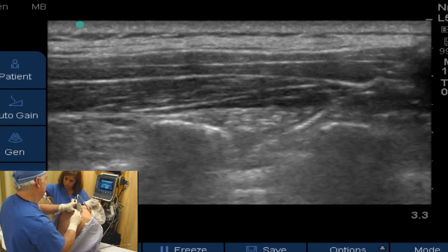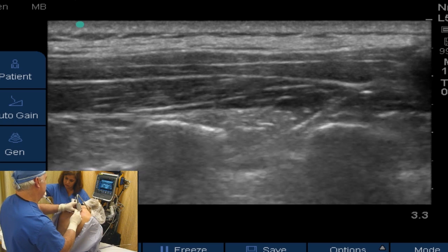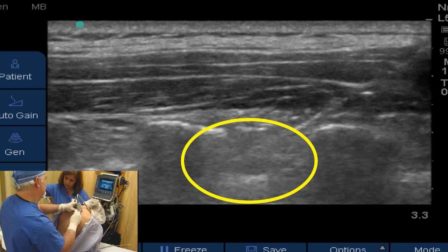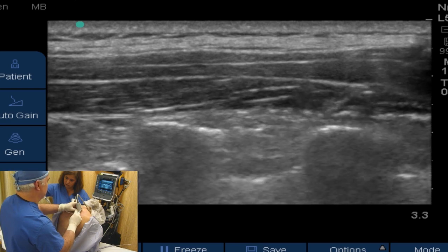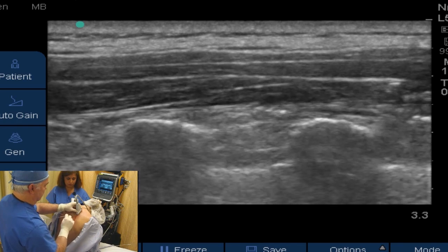As you can see, it's very gentle, very slow movements of the needle. You take your time, you try to advance. You see the injection there pushing the pleura down, but you take your time to get this needle exactly in the right place. It's a very delicate block and you have to see exactly what you're doing to be able to make this successful without having the complications that can very easily occur.